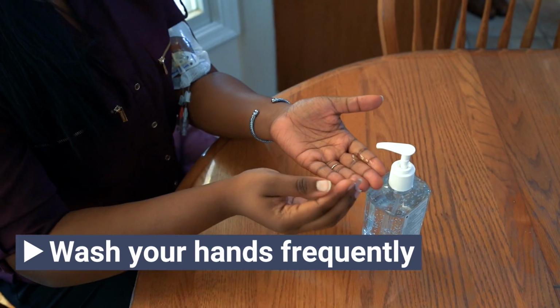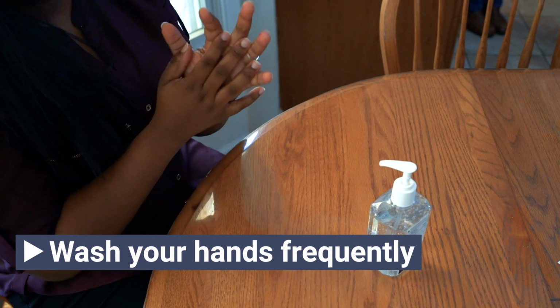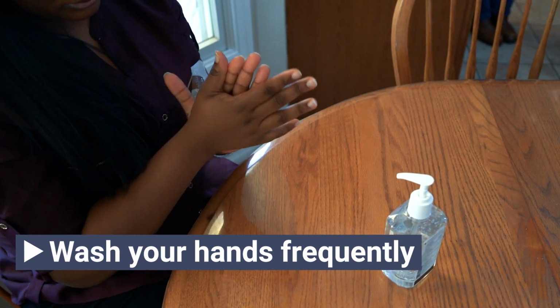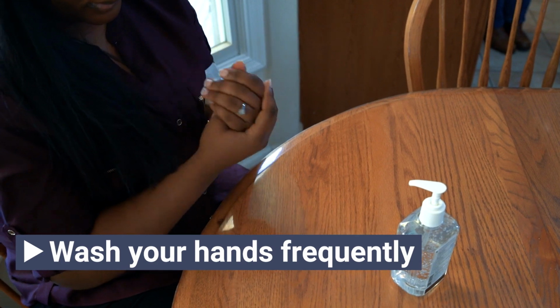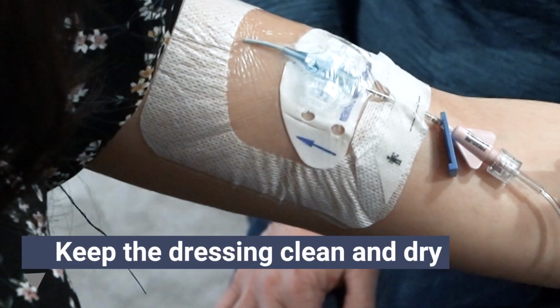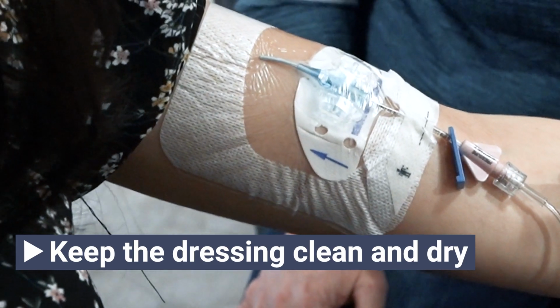Hand sanitizer can be used instead of soap and water, except when your hands are visibly dirty and after using the restroom. Be sure to rub your hands together vigorously with a nickel-sized amount of hand sanitizer for at least 20 seconds. The dressing over the IV line is important in keeping the IV line from getting infected.